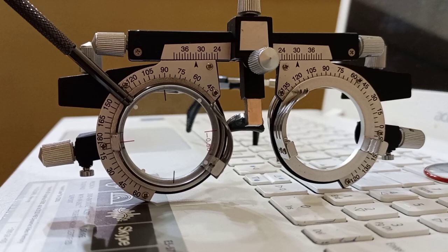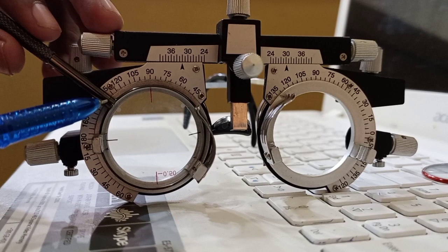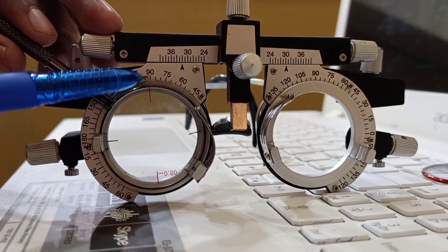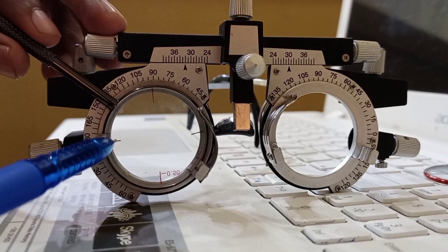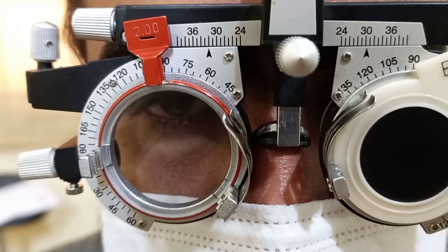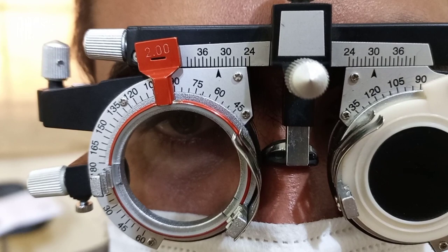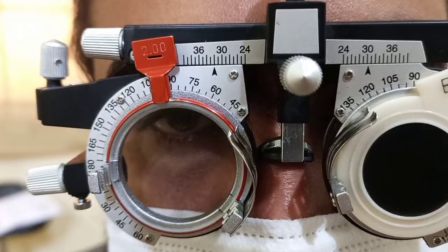When I flip the Jackson cross cylinder at the same 135 axis, the red line of the minus cylinder is coinciding with 90 degrees and the black line of the plus cylinder axis is coinciding with 180 degrees. Now before starting the Jackson cross cylinder procedure, the best vision sphere should be established before the patient's eye — in this case, minus 2 spherical is our best vision sphere.